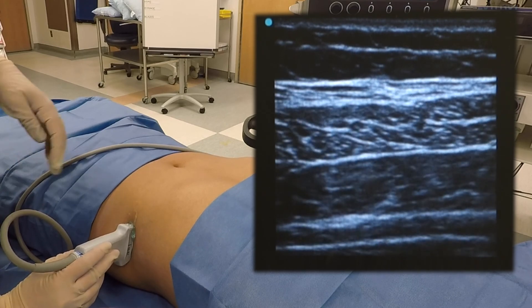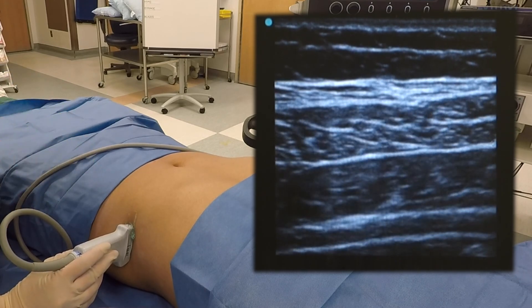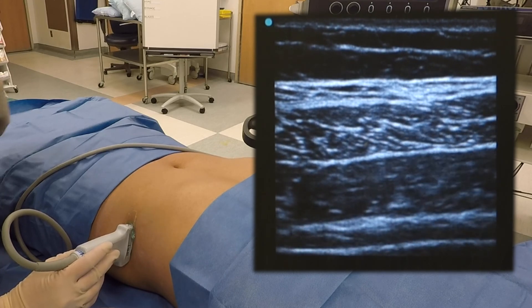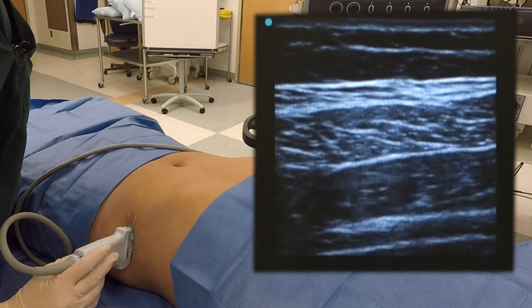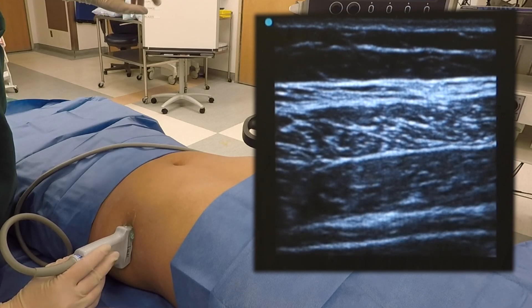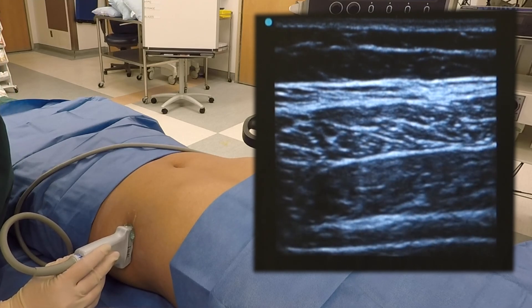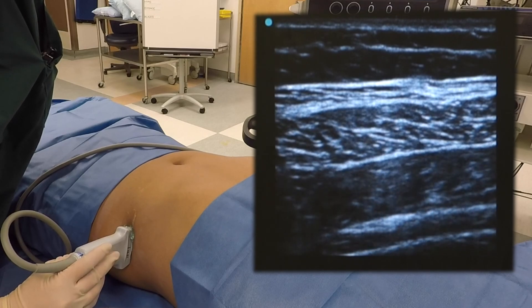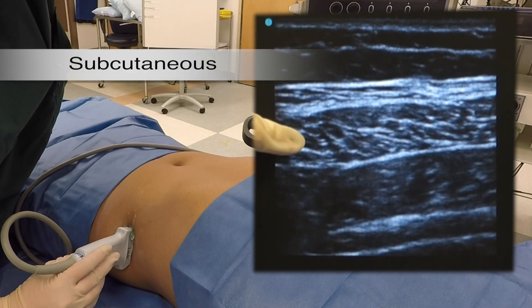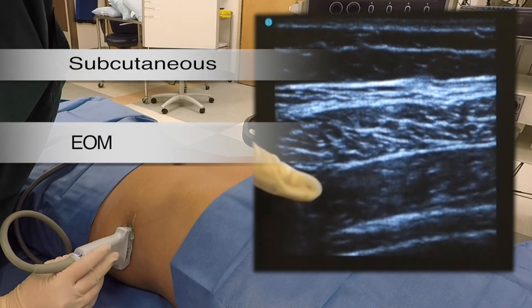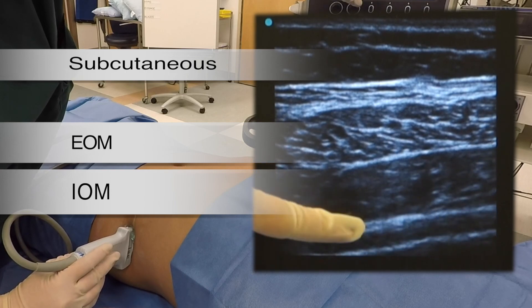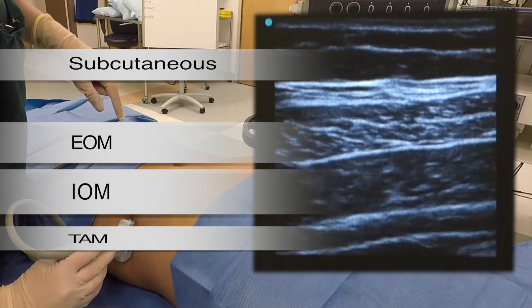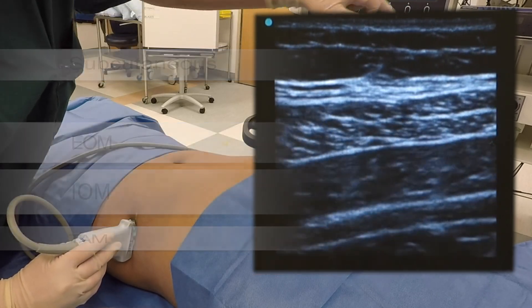Next, check the orientation of the ultrasound. Ensure that the right side of the probe is the right side of the ultrasound screen. Then, place the ultrasound probe on the mid-axillary line parallel and superior to the iliac crest. Next, identify the sonoanatomy: subcutaneous tissue, EOM, IOM — which is usually the thickest layer — and the TAM. Below the TAM is the peritoneum and you may note bowel peristalsis.